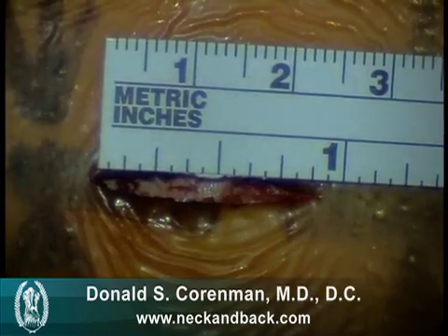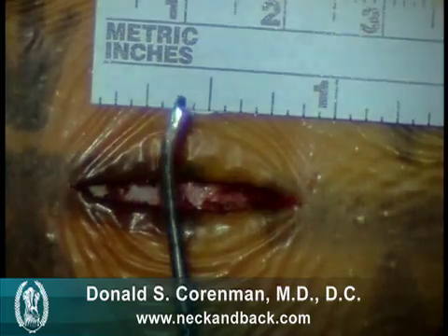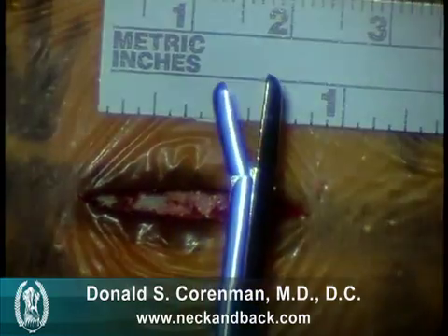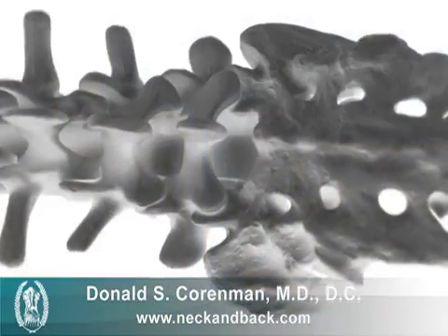Our incision that we make, as you can see, is less than an inch long. These are some of the tools that we utilize to do the surgery, and these tools will look to be much larger than normal simply because of the magnification that we use from the microscope.